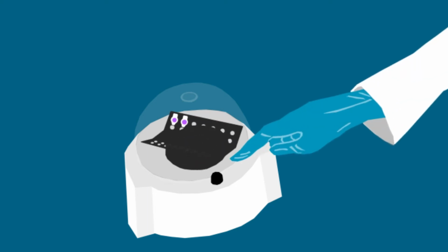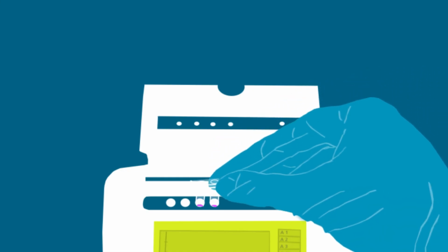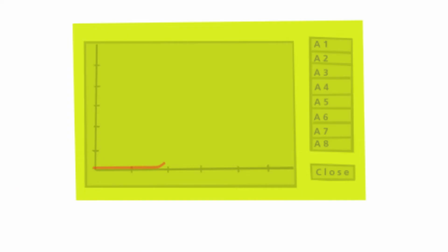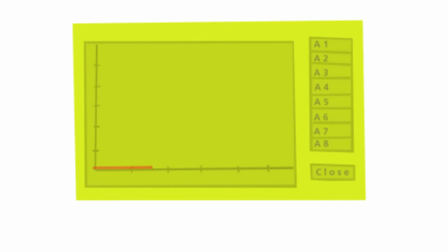There. Everything is ready. Now I place the reaction tubes in the analyzer and start up LAMP at a constant temperature of 65 degrees Celsius. In technical language, this method is termed loop-mediated isothermal DNA amplification. It makes use of the fact that different species of living creatures differ in terms of their genetic makeup, in other words, their DNA sequence. This allows us to distinguish particularly dangerous, regulated plant pests from harmless, non-regulated organisms.